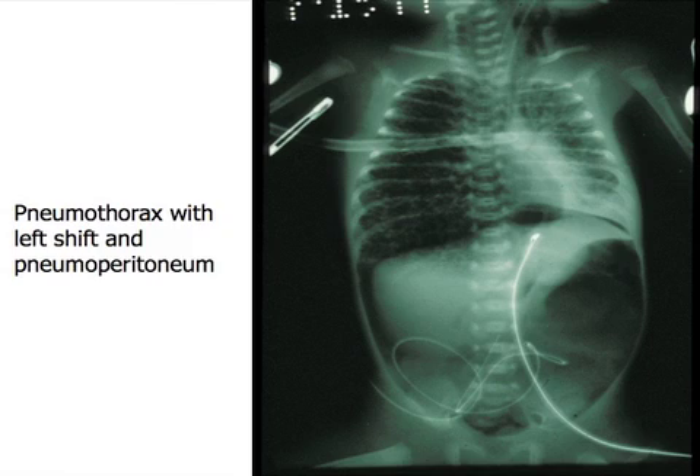Look at this — this is a red rubber catheter. How many holes do you see? Three. But a red rubber catheter normally comes with just one hole. So there are some extra holes cut in here. This baby had recurrent pneumothoraces, and the thought was: if we put some extra holes in, maybe we won't have to keep replacing this chest tube. Well, that didn't work — he continued to have pneumothoraces.